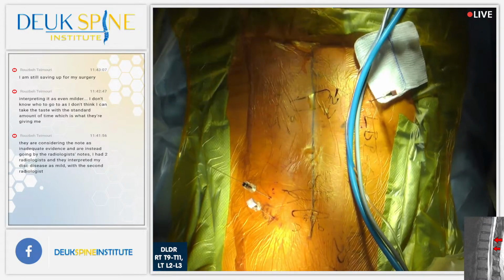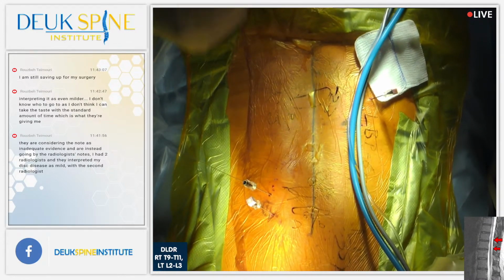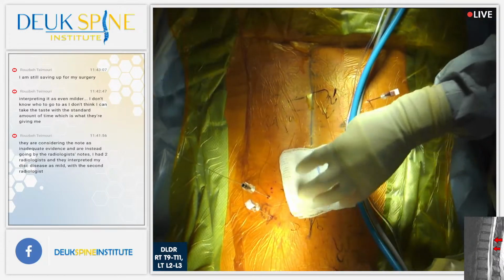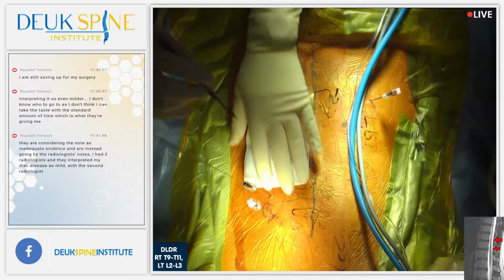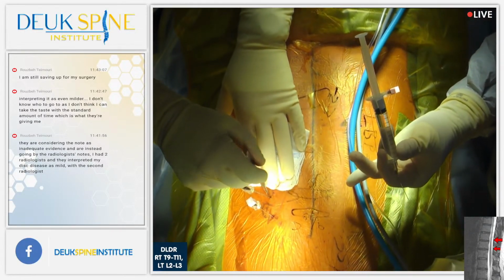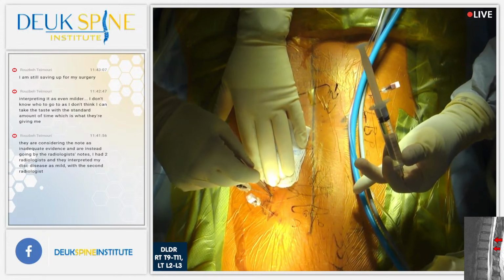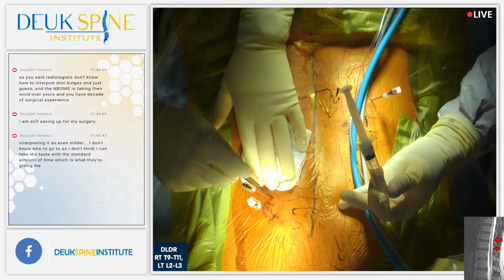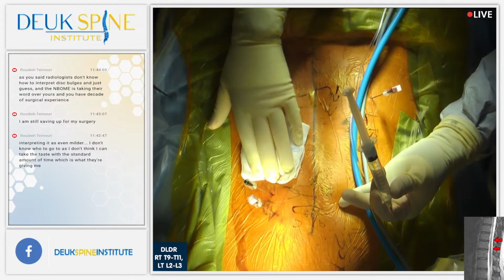That's just medicine going in your arm. You're doing great. Okay, that's the propofol. Lay still. Can you check his arms again? Make sure nothing's putting pressure on him. You're doing great, my friend. When you wake up, we'll be done. We're going to do everything through a 7mm incision. That's the whole surgery, 7mm.